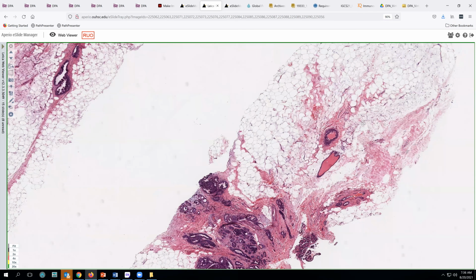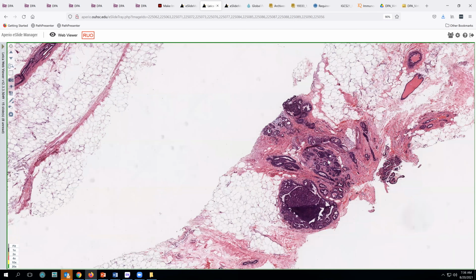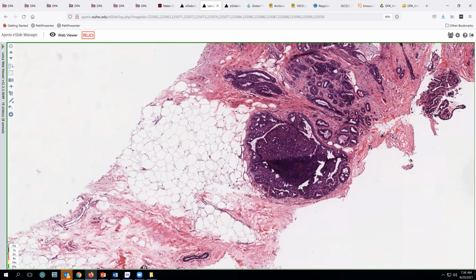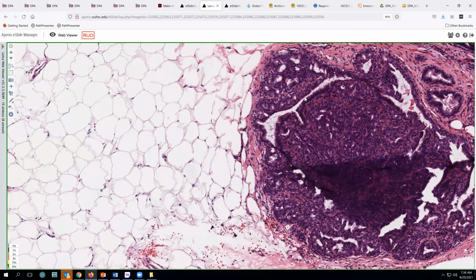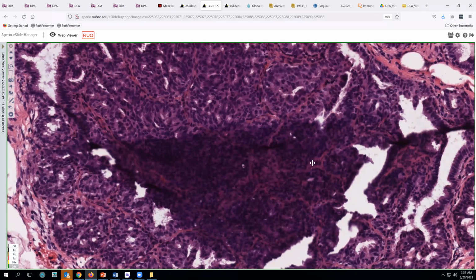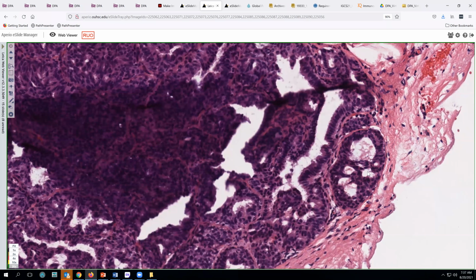We'll take a look down here, and I think here we can see more of this hyperplasia type of appearance. Note the lobularity here. That's very helpful in excluding malignancy in terms of the variability here. And this also has some of those intraductal papilloma type of features that we saw in that detached fragment. But here you can see in a portion of the wall, again, this sort of hyperplastic appearance of some of the surrounding glandular tissue.